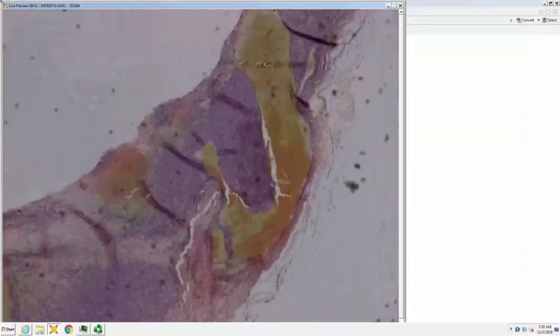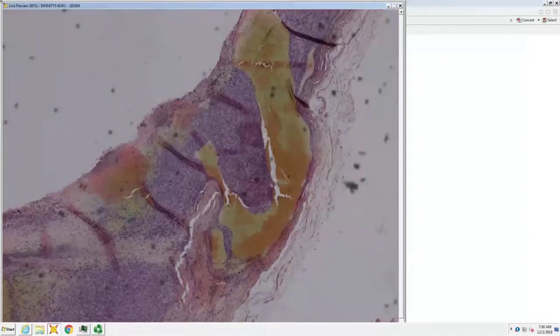And so this is angiomatoid fibrous histiocytoma, not to be confused with an aneurysmal DF. Aneurysmal DF is benign. This is a low-grade sarcoma. So unfortunately, the names overlap, right?